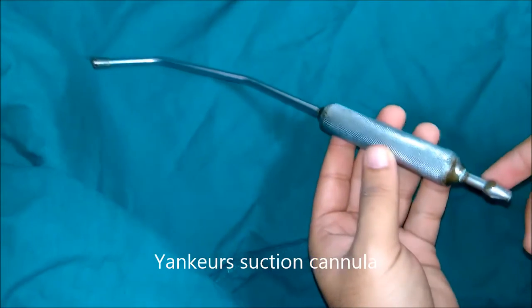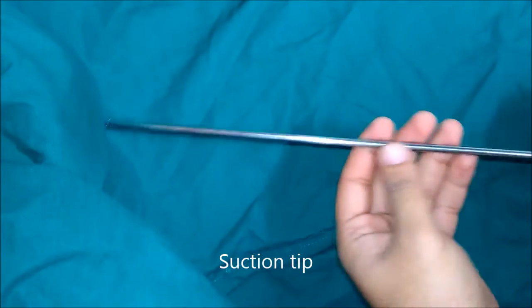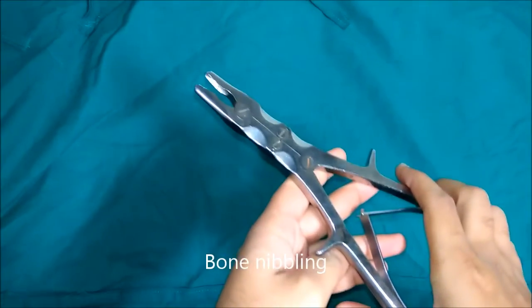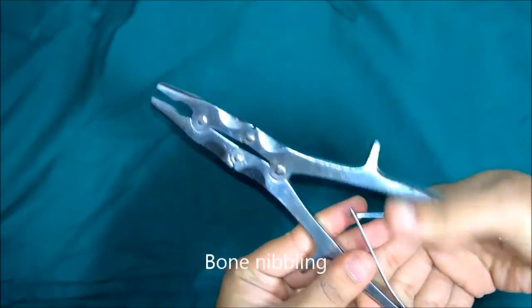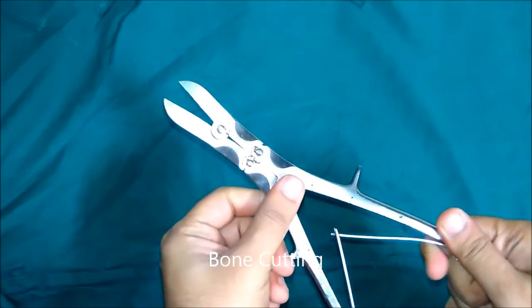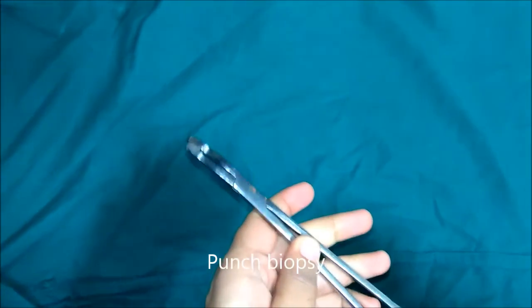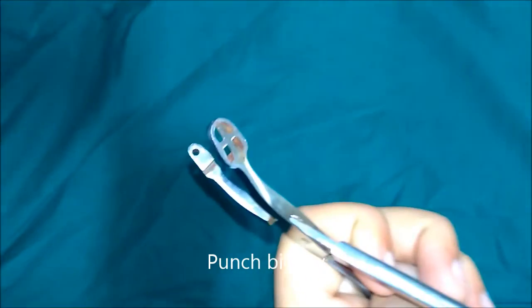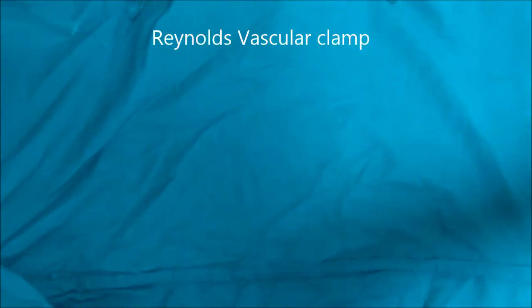This is Yankauer's suction cannula. This is a suction tip. This is bone nibbler, double action. This is bone cutter, double action. This is Reynolds vascular clamp.